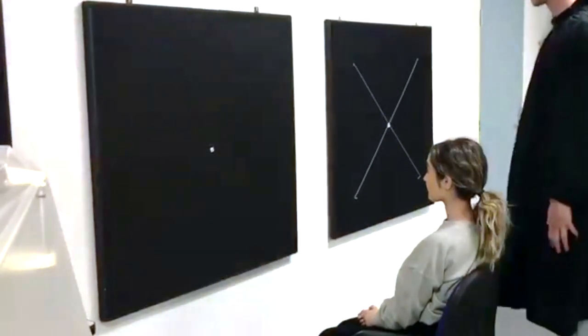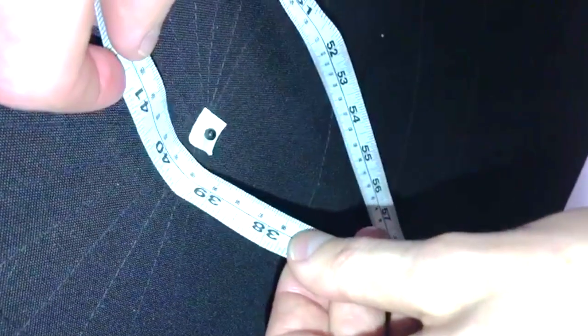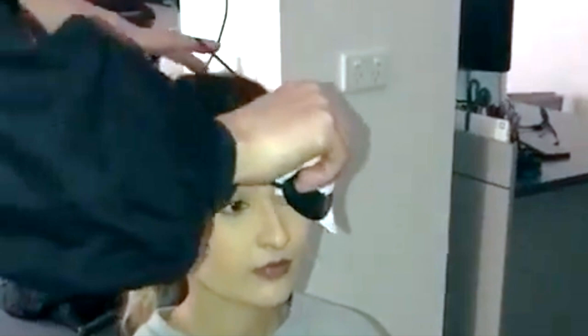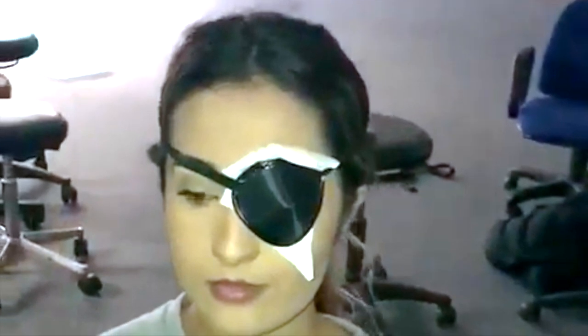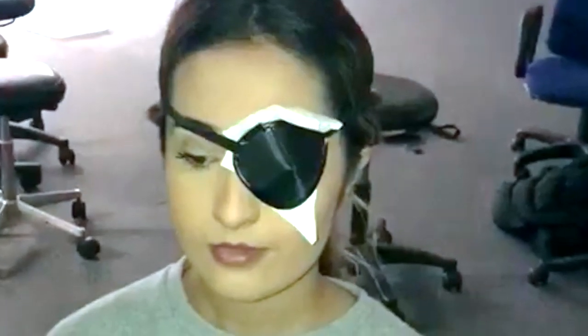It is crucial for the examiner to check if the patient is aligned correctly with the central fixation target. The patient's eye that is not being tested is occluded. Typically you would test the right eye first so it would occlude the left eye. Ensure the occluder is on correctly and that the patient is not peeking from the covered eye.